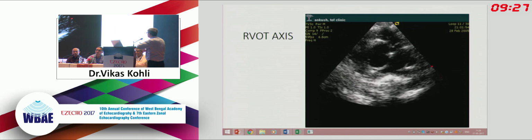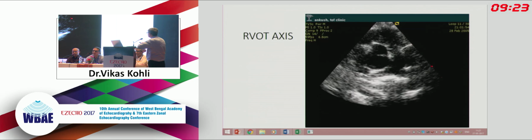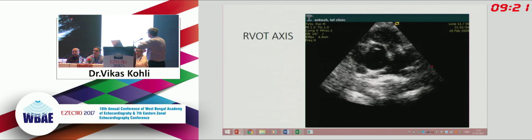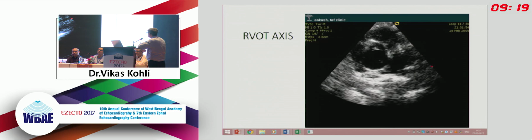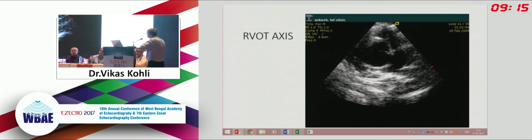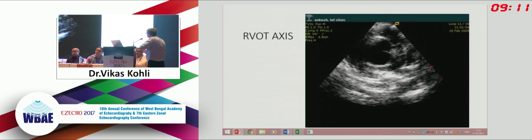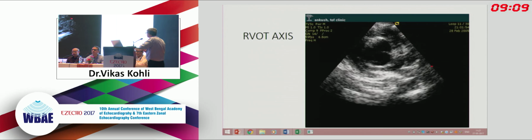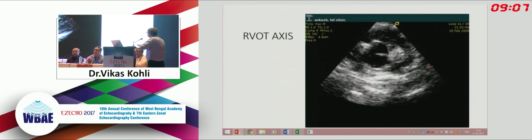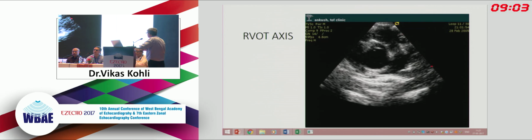So in this one single view, you're able to see the outflow tract, the subvalvar area, the valve leaflets, which Amitabh had said are thin and pliable. Amitabh, any comments about this white zone just above the supravalvar area? Yes, that is the confluence. There's a branch pulmonary arteries wherever the branch pulmonary arteries are taking off. As per this picture, the branch pulmonary arteries are fair sized, but we need to measure it on a still picture. I guess this should be a child of approximately 1 to 1.5 years.